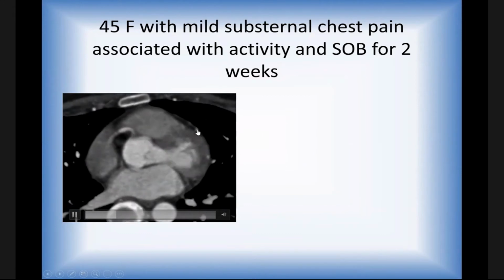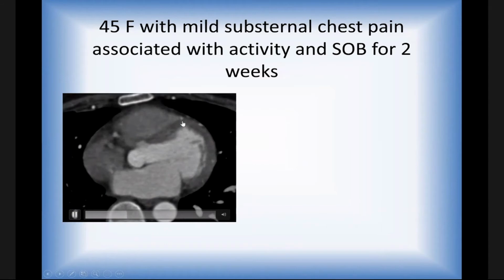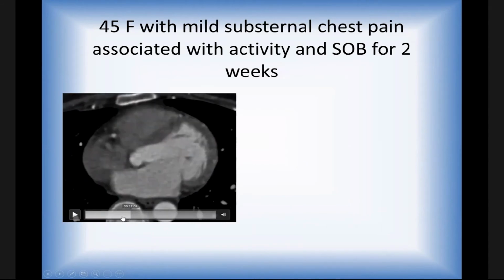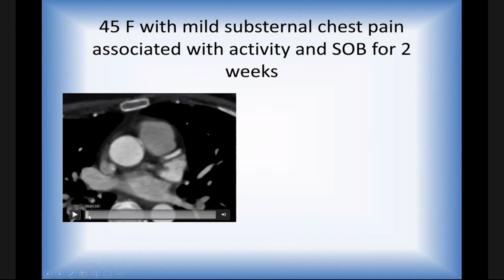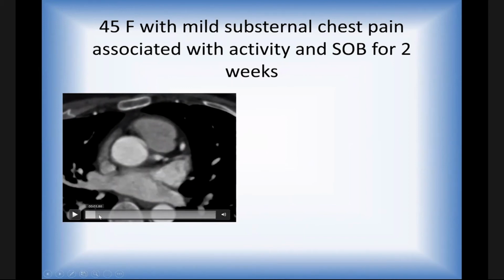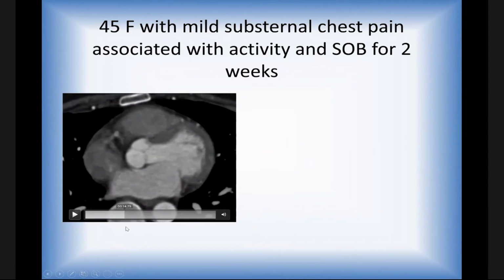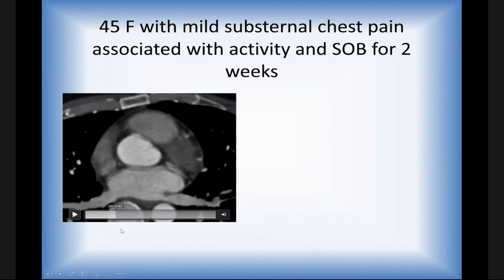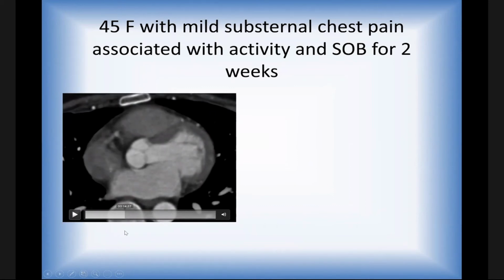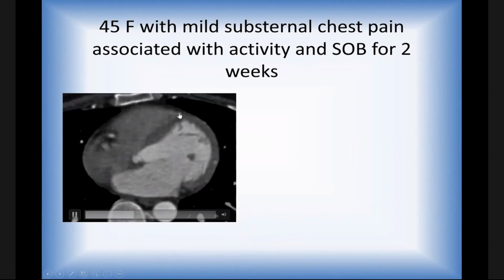This is not the LAD, this is a diagonal. This is our LAD here. I'm going to go back and then look at the LAD again. Follow it with me, follow it, follow it. It's gone, and then it's coming back. So the LAD seems to disappear for maybe 1 centimeter or less than 2 centimeters. And it is up here again, right here, this is the LAD.